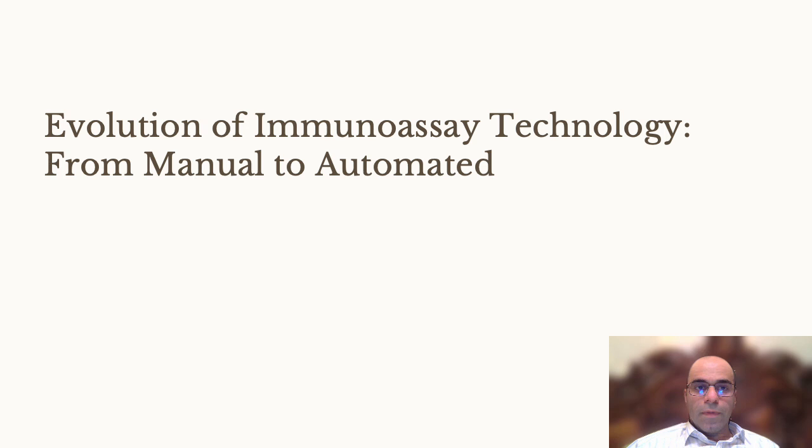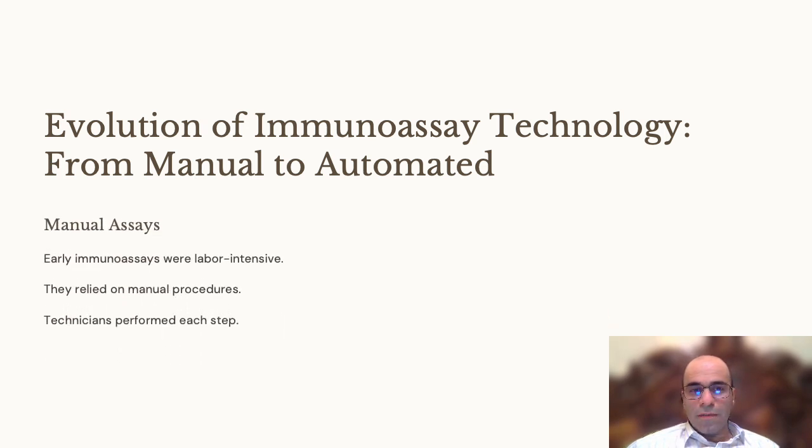Okay, let's take a look at the evolution of immunoassay technology from manual to automated. Manual assays: early immunoassays were labor intensive and time consuming procedures that required skilled laboratory technicians, and they relied on manual procedures, including precise pipetting, sample preparation, washing steps, and visual interpretation of results.